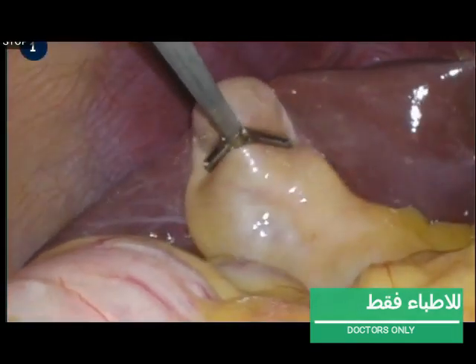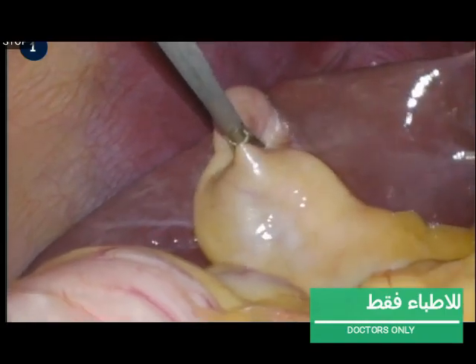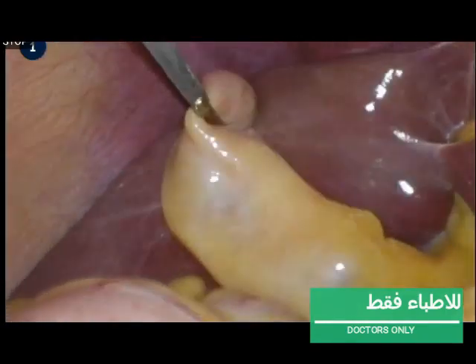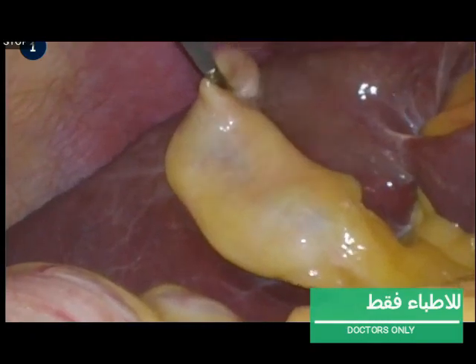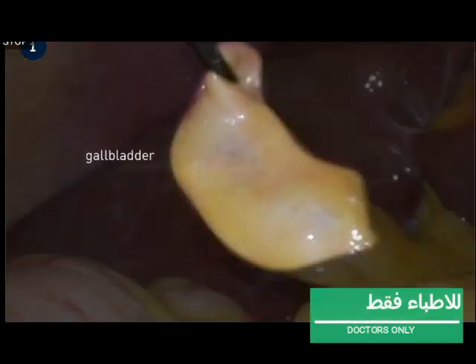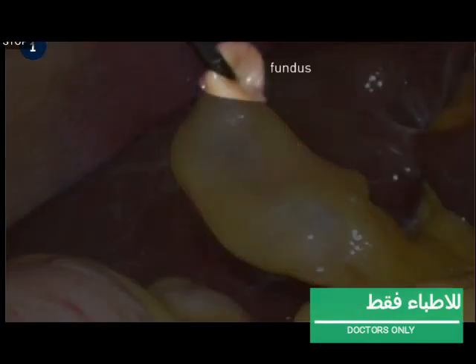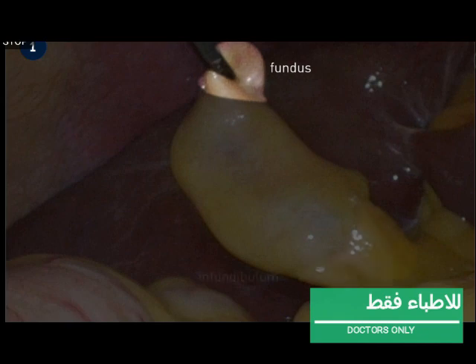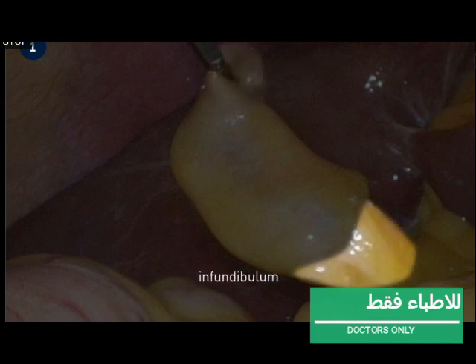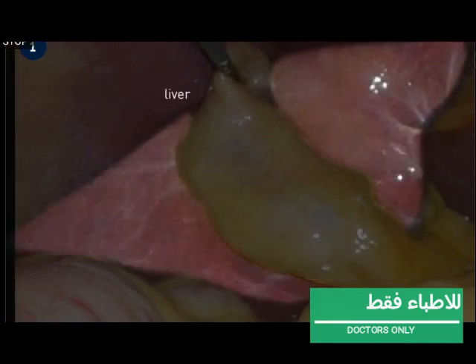If retraction is not possible due to a hydropic gallbladder, it can be decompressed by puncturing it. In this overview, you can see the gallbladder, the fundus of the gallbladder, the infundibulum, and the liver in the background.